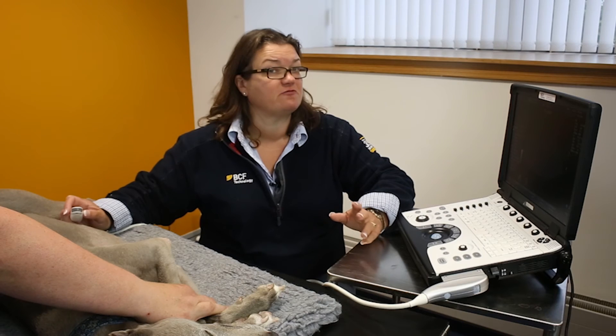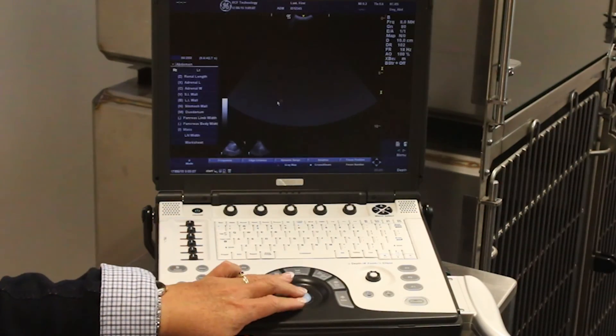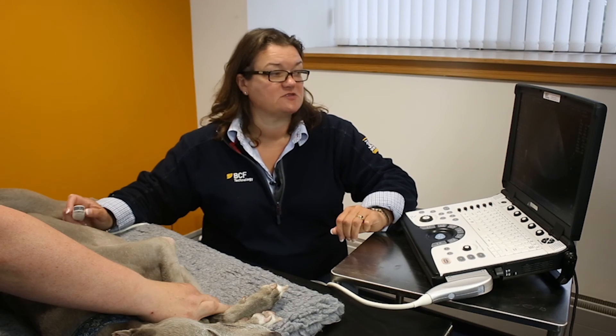This scanner is set up to save five seconds retrospectively from when I hit the P1 key. And you'll see down here that we have the clip saved — and that's my five-second loop.